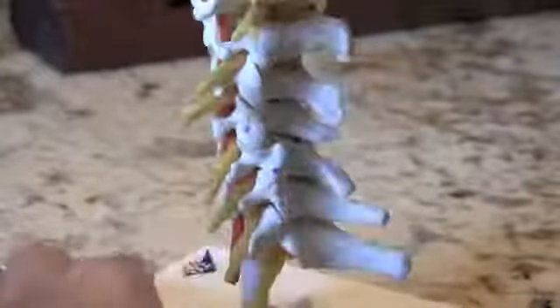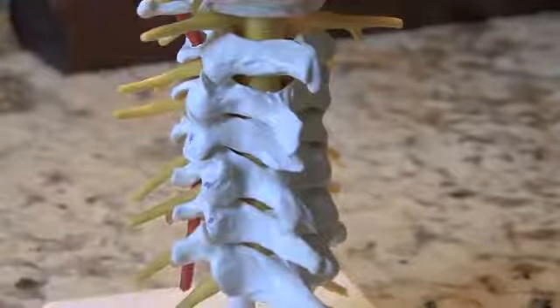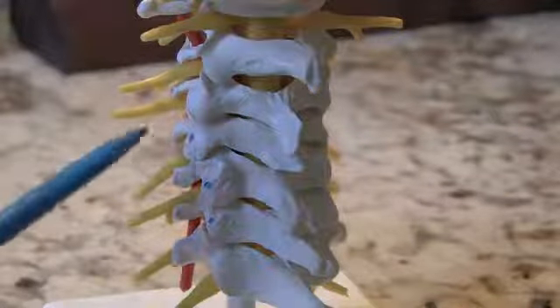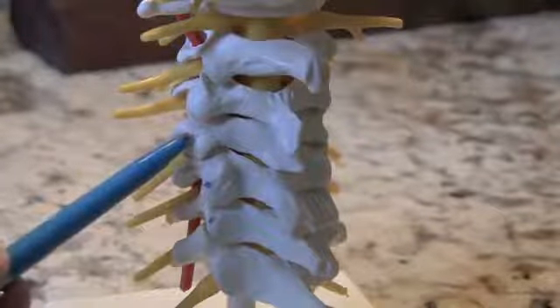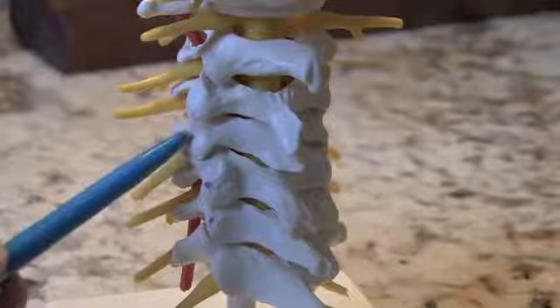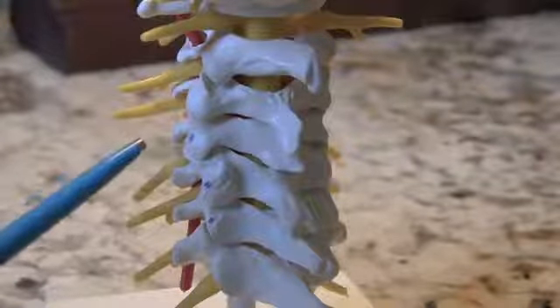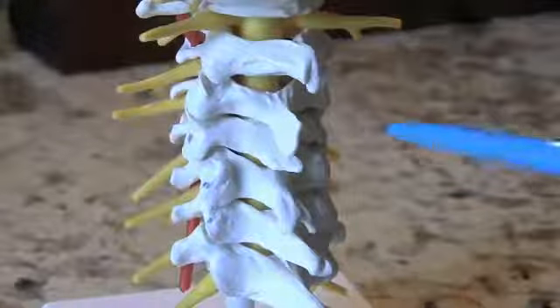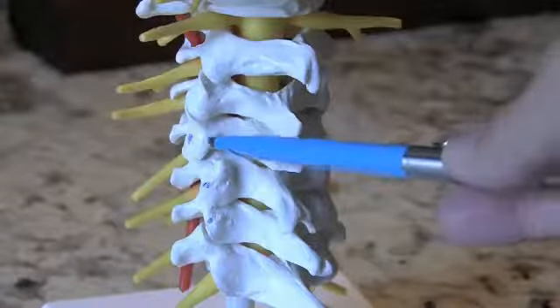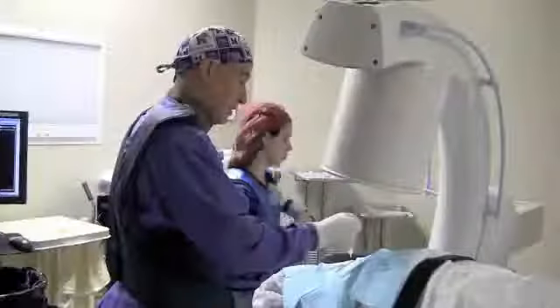This is a model of the cervical spine, looking at the spine from the side. And as we turn around and look at the back side here, I wanted to show you the area where we try to do our medial branch block. This is the area where the nerve goes to the facet joint. For instance, this facet joint right here is innervated by a tiny nerve here and here. It's nowhere near the large nerves that go down to the arm. And we're guiding, by fluoroscopy, a tiny little needle, 23 gauge, down to try to block right here and right here. Just numb that skin up for you there.